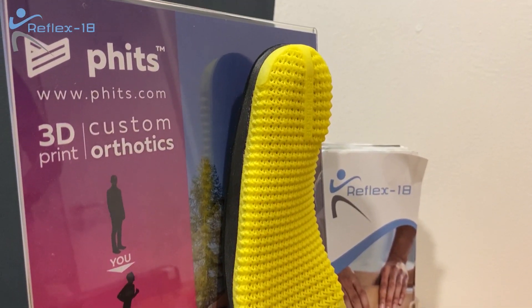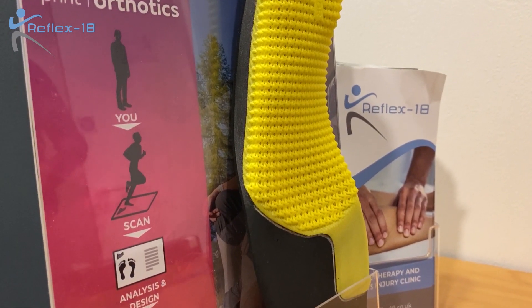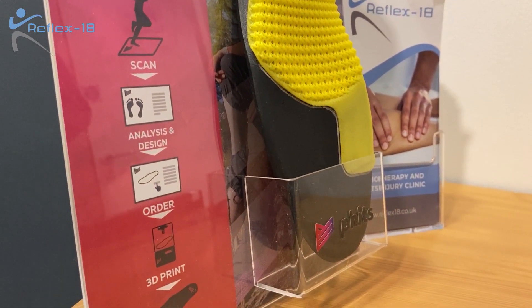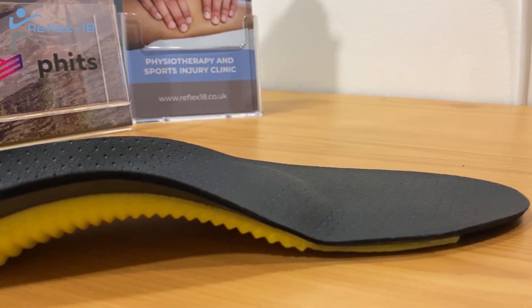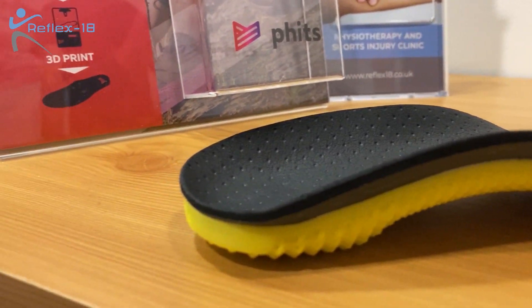Once we've designed this insole, we send the data to Belgium where a team of podiatrists will look over it, check the design and make sure they're happy with it. If they are, they'll 3D print it and send it over to us, and we'll call you back into clinic and get it fitted into your shoe. This allows you to have a custom made insole for your shoe that works well for you.